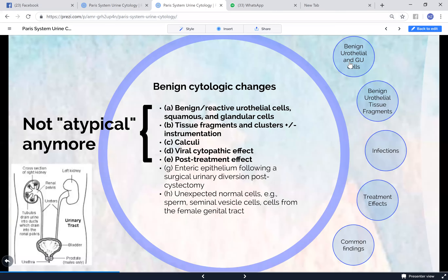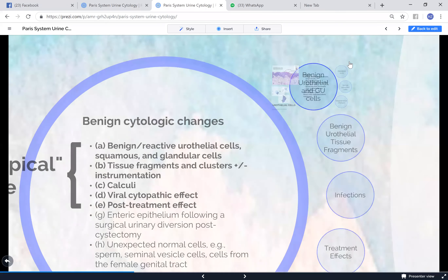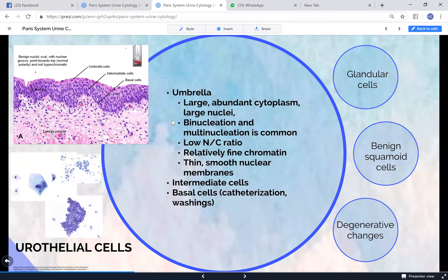Ileal cells and all similar findings are now considered negative for high grade. To understand the components you see in urine cytology, remember the histology: basal cells, intermediate cells, and umbrella cells. This epithelium used to be called transitional epithelium because it was considered somewhere between squamous and another type, but now it is recognized as its own entity - urothelium.